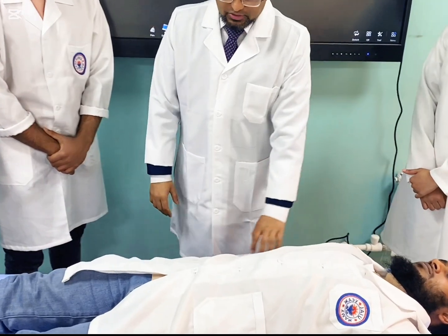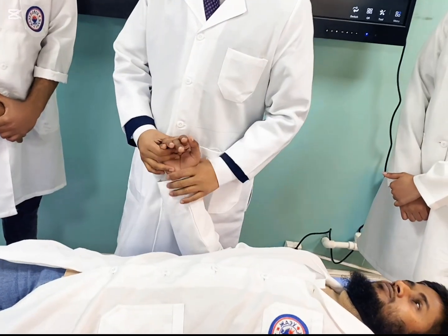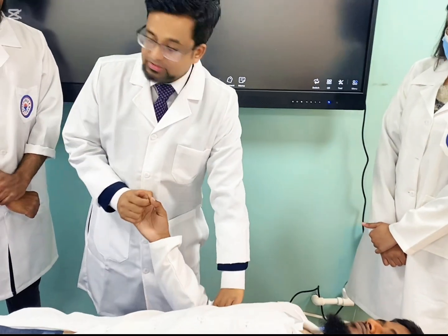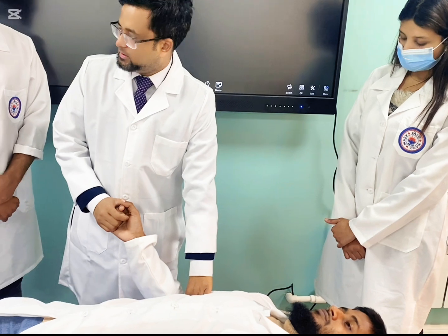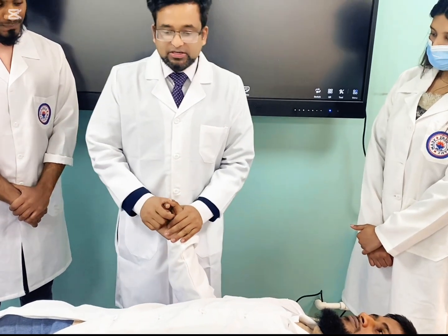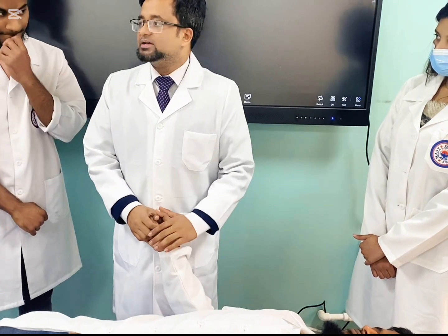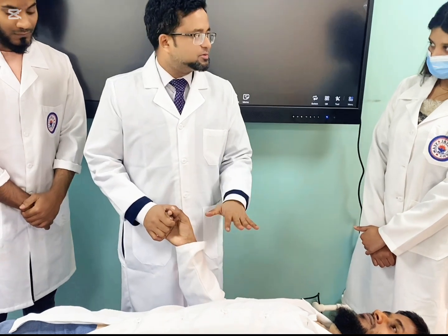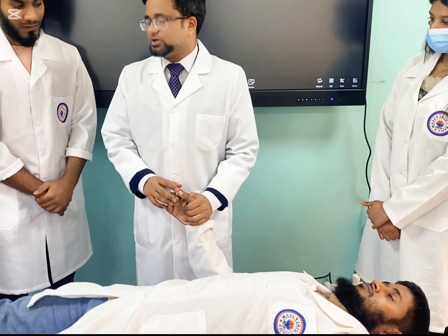So temperature, respiratory rate, then pulse and blood pressure. Blood pressure, you know how to check blood pressure, right? We'll use a cuff here. The patient will wear a cuff here, then we'll check the blood pressure. But it is better to check blood pressure in sitting position. Understand? The patient will be relaxed, sitting in a chair. Then you can check blood pressure.